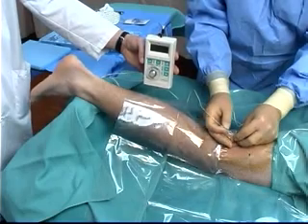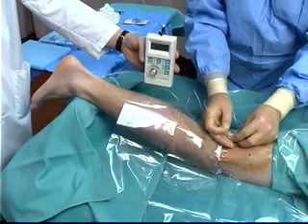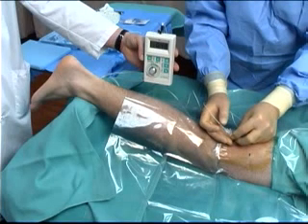Advance the catheter. If the motor response stops, it simply means that the catheter is moving away from the nerve. Carefully withdraw the catheter to inside the needle shaft again, rotate the needle a quarter turn clockwise or counterclockwise, and advance the catheter again. If the motor response again ceases, withdraw the catheter again to inside the needle shaft and advance or withdraw the needle slightly before advancing the catheter again. Repeat these maneuvers until the motor response remains positive and brisk during advancement of the catheter. Make sure that the catheter is always withdrawn to inside the needle shaft, that the broad black mark on the catheter is always visible before the needle is manipulated.